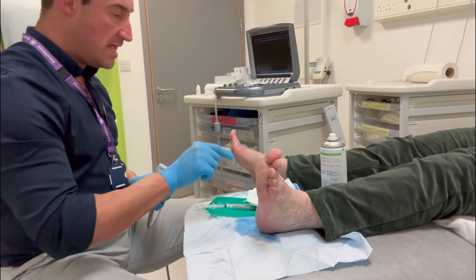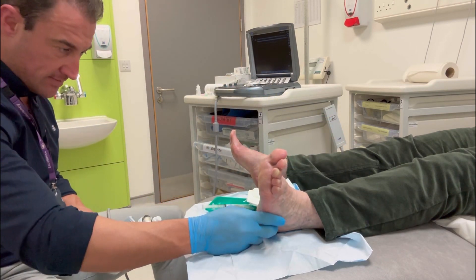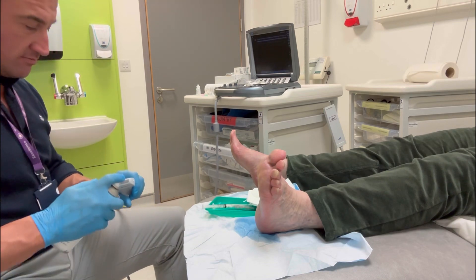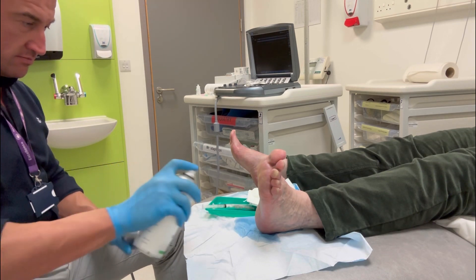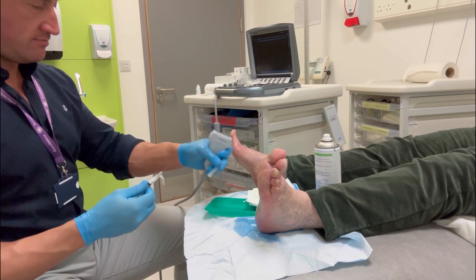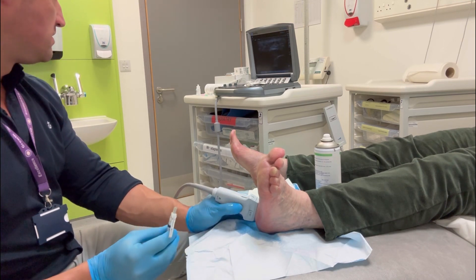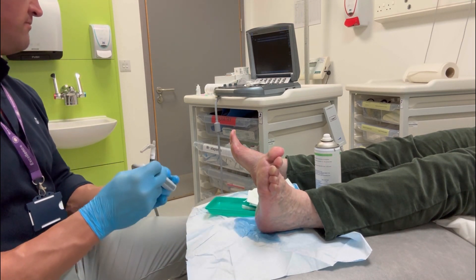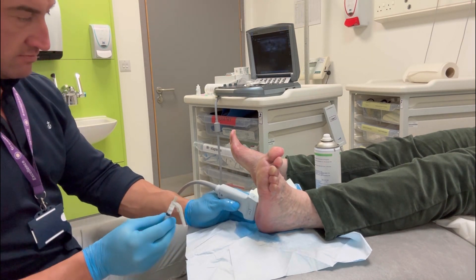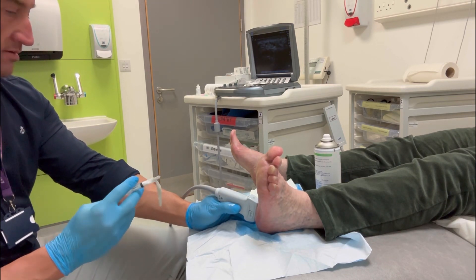This is the treatment injection, and I utilize depomedrone, which gives a nice slow action and a long-lasting result. This patient is ideally suited for an injection — the plantar fascia on ultrasound scan is not too swollen, so not too thick, but has inflammatory color Doppler signal, and I find these cases work best.